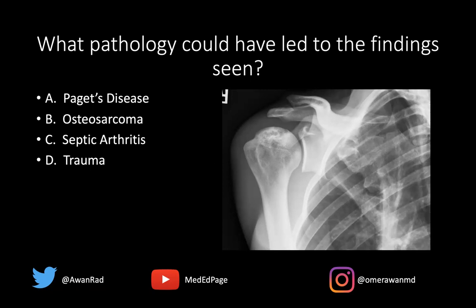What we're seeing here is an area of focal geographic serpiginous sclerosis involving the subarticular aspect of the humeral head. Notice that there's no articular collapse at the glenohumeral joint, no fracture, no subchondral fracture — just this geographic area of mixed sclerosis and lucency that's fairly well-defined along the humeral head. This is a nice case of avascular necrosis or osteonecrosis, and of the four choices, the only one that typically and characteristically leads to osteonecrosis is trauma.